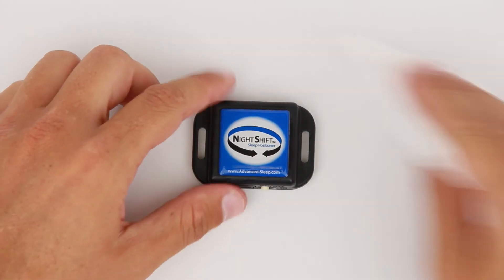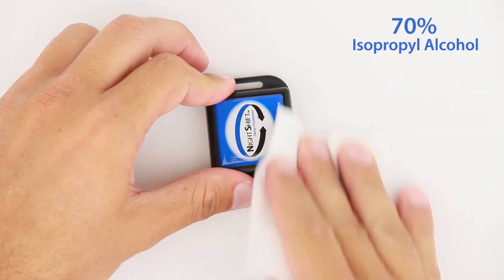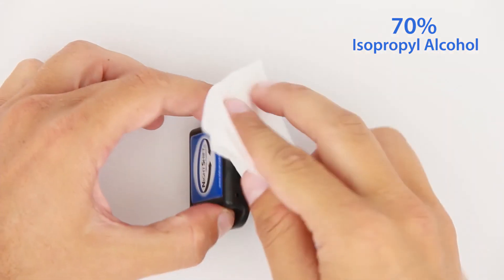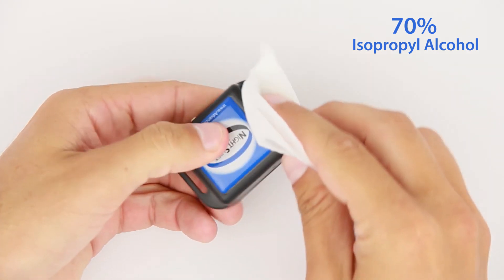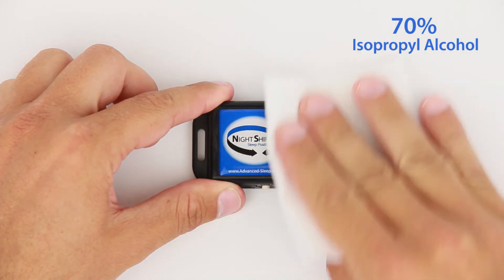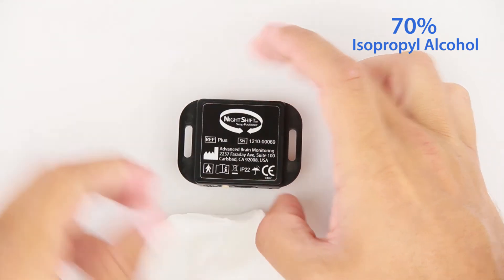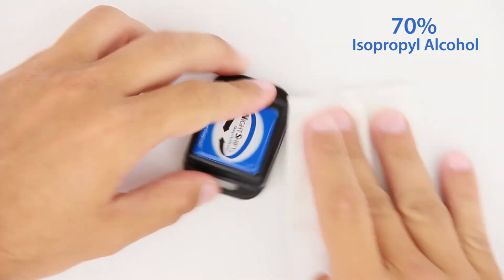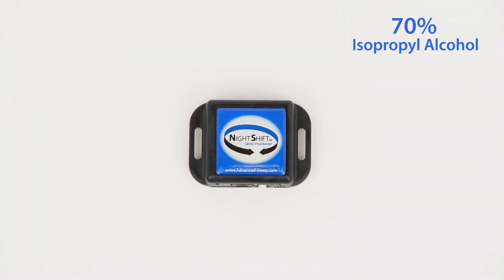To clean the device, wipe all surface areas of the device enclosure with a 70% isopropyl alcohol wipe. All surface areas should remain wet for at least 15 seconds. Using a new alcohol wipe, repeat the cleaning, allowing all surface areas to remain wet for 15 seconds. Repeat as needed until completely clean, then allow to air dry.